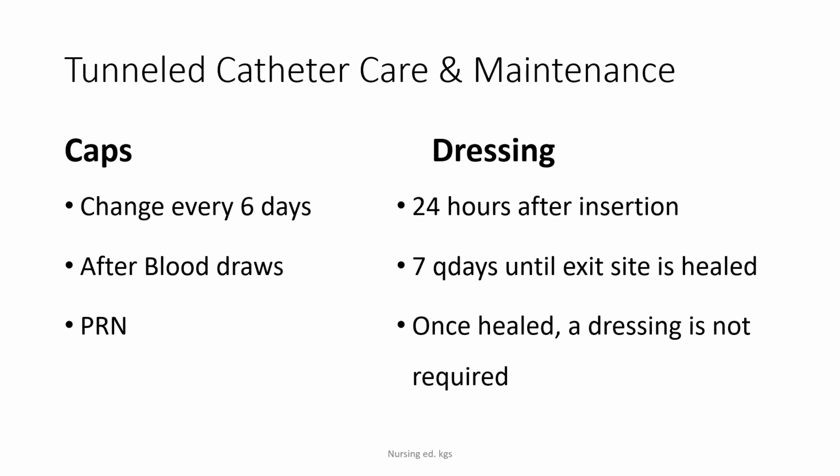A newly inserted tunneled central venous catheter will have 2 insertion sites, an upper insertion site and a lower insertion site. The upper insertion site is secured with sutures and requires application of a securement device until it's well healed, and healing will take place in 7 to 10 days.